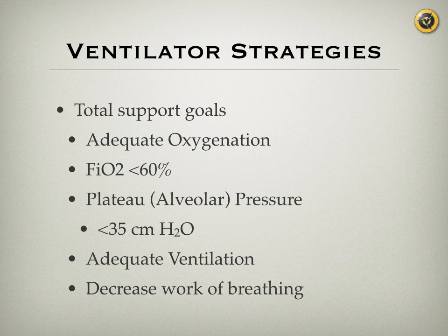But remember, this is important in order, meaning that you cannot sacrifice the first point so you can achieve the second point. You cannot say, I will increase the plateau pressure so I can get ventilation and normal CO2. No, that's not acceptable. You can actually accept hypercarbia and respiratory acidosis in patients, because to achieve normal CO2, you would have to raise your pressures or volumes, and then eventually decrease the work of breathing.